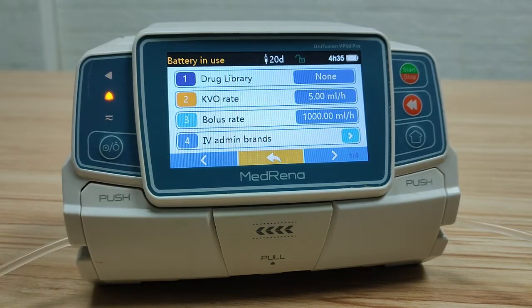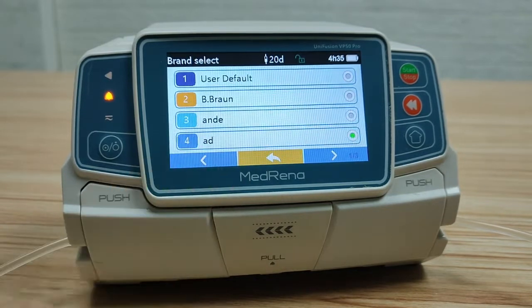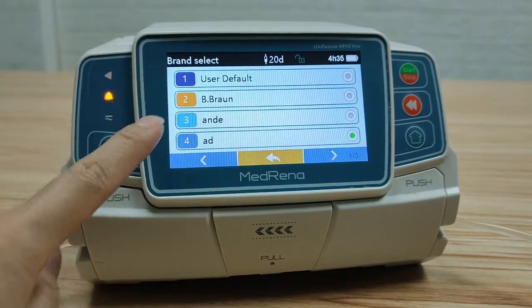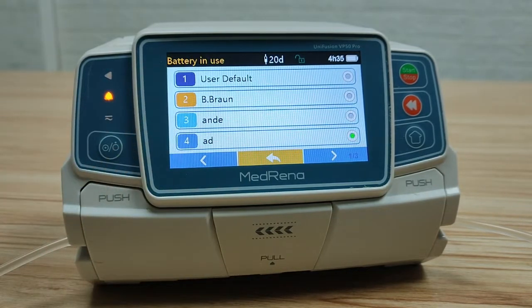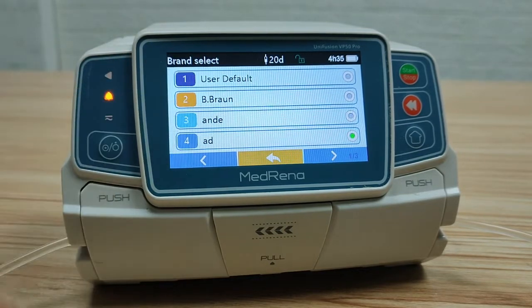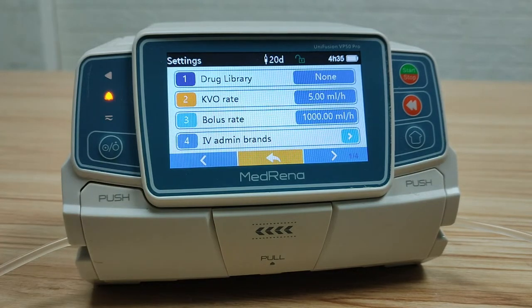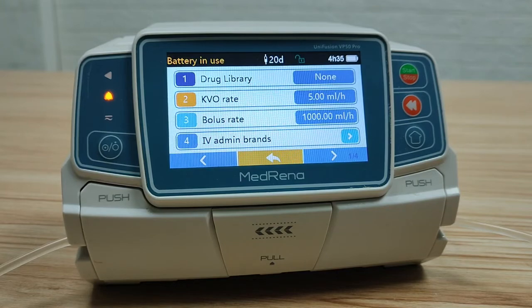IV brands: we can choose the brands of IV set currently in use, and the IV set brand will be shown on the title bar. We can store up to 20 brands of IV set into the system.